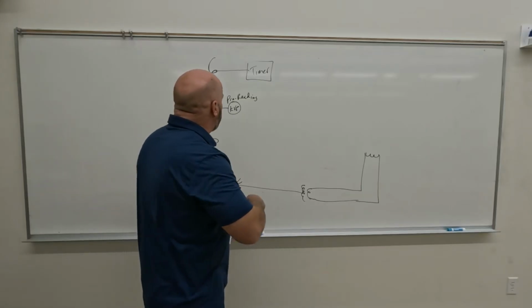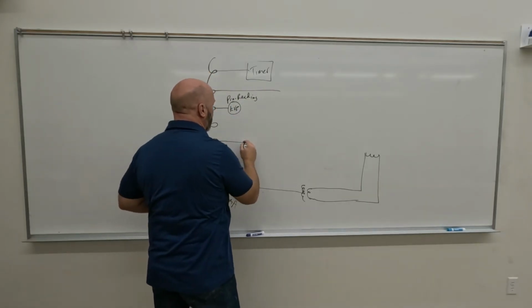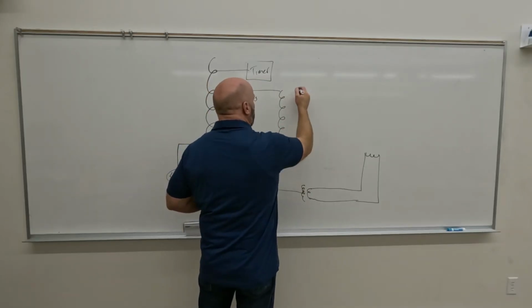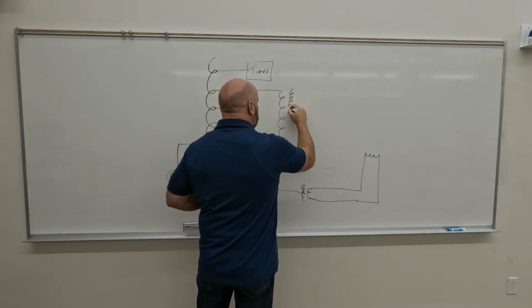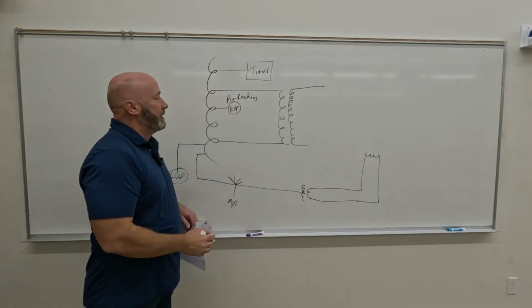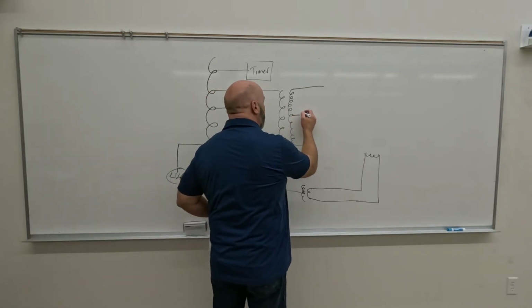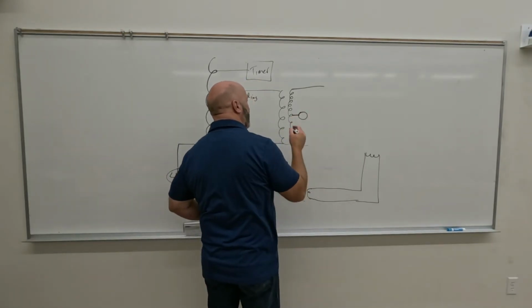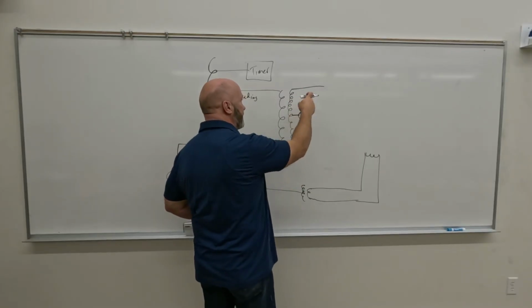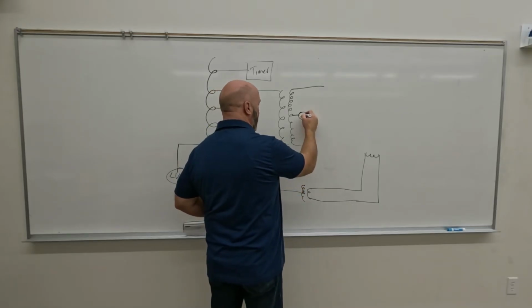Okay, so after the electricity comes out of the autotransformer, it goes into the high voltage transformer. We're not going to talk about the turns ratio or anything. We've kind of done that to death as well. So it goes through that. We've got one thing over here that's wired directly into the center of the high voltage side of the high voltage transformer, and that is our mA meter.